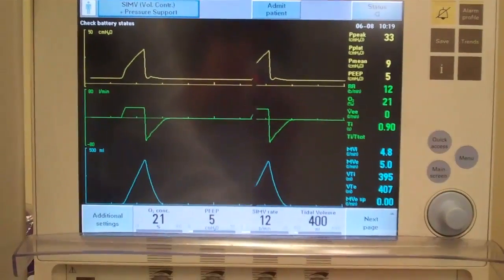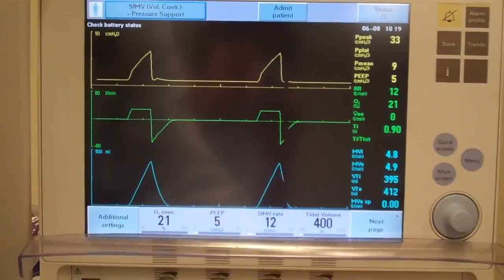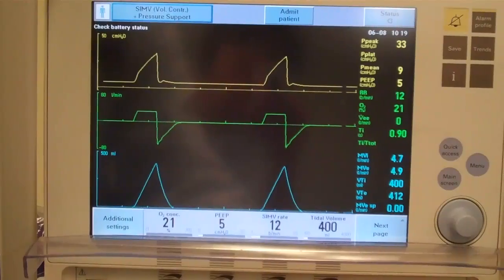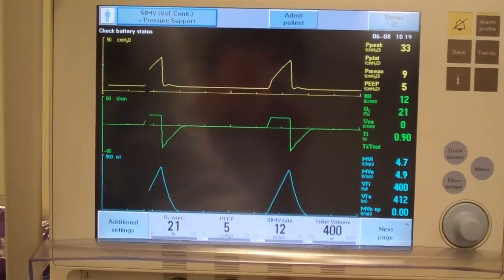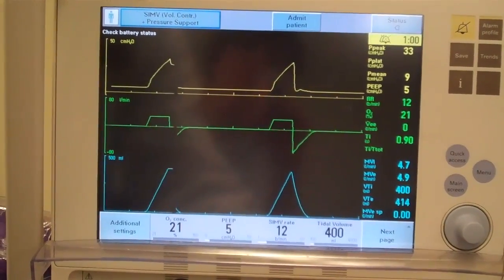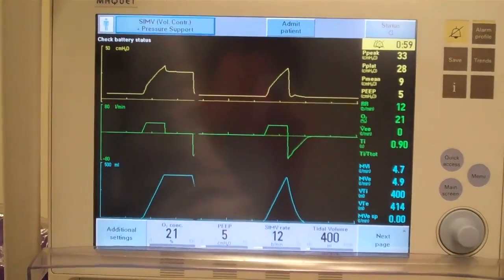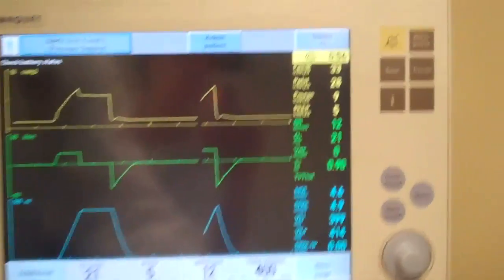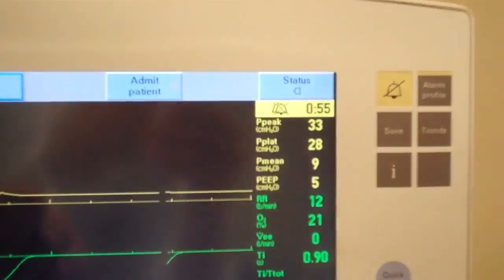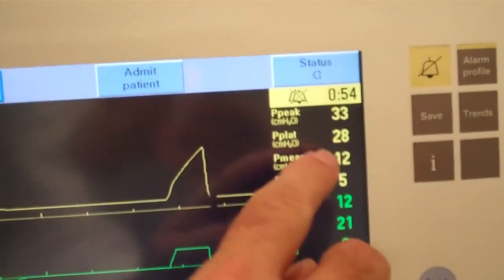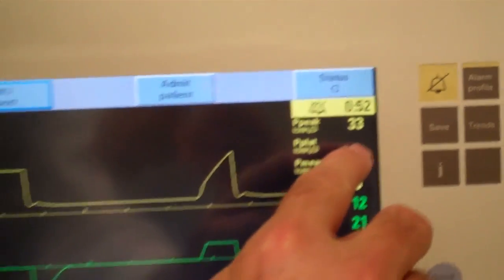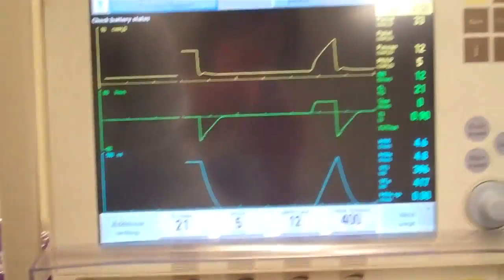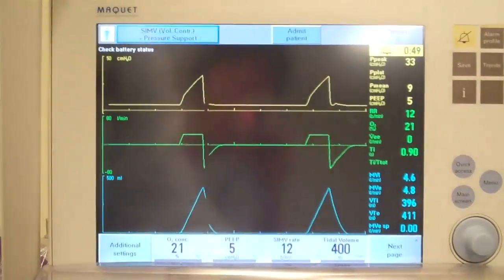I'm going to wait for a positive pressure breath here and then we'll get a pause pressure. Now there was the pressure right here and we can see that the plateau pressure just disappeared, but it was still about 28 before it disappeared.